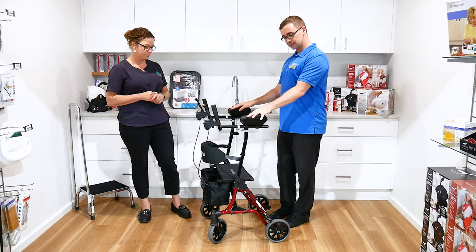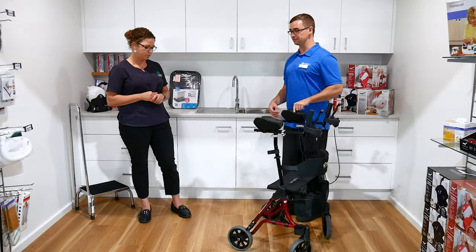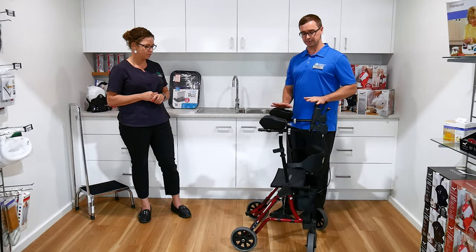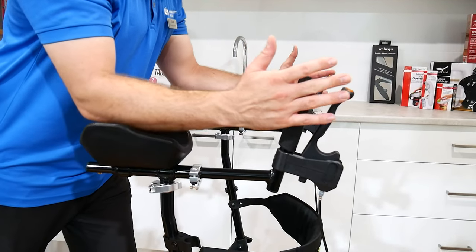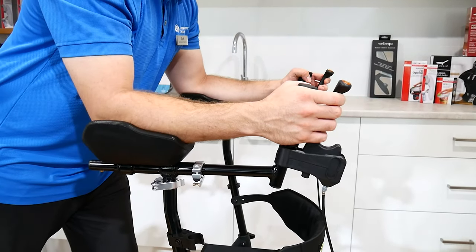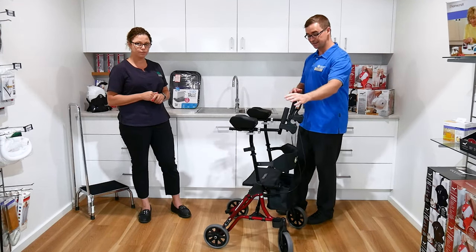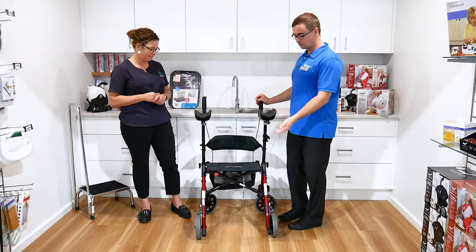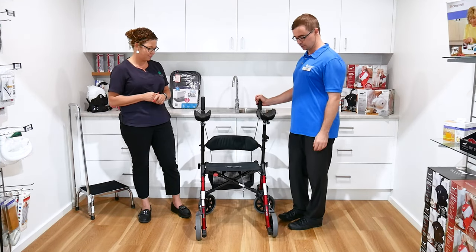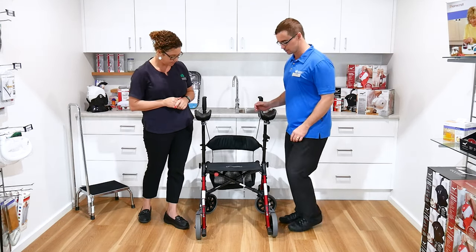People may have seen these in rehabilitation wards, in hospitals, and they're usually a bulky sort of fixed frame. The lovely thing about this model is we now have brakes up at the hand, which a lot of the older models did not have, so it gives independence in its use. It also has a seat, which a lot of those models certainly don't have either. And it has a lovely fold function, which gives you the ability to take this out in the community as well.